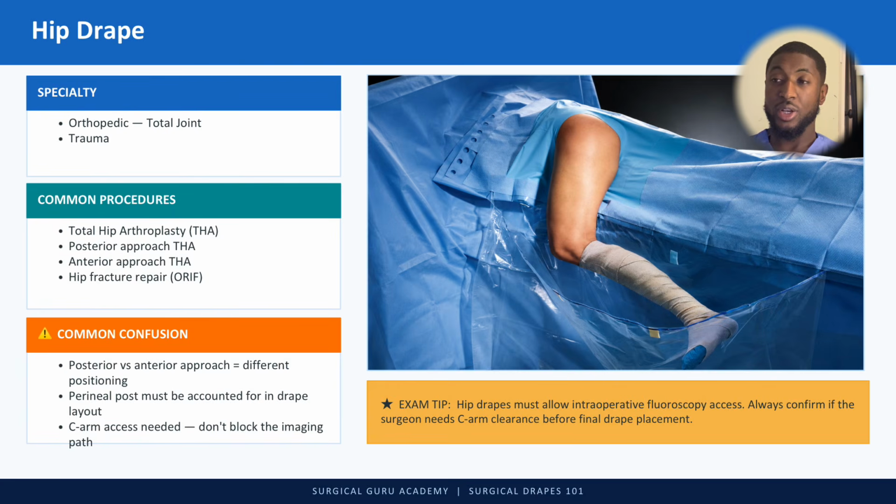So with the shower curtain, the last time that I did it, the doctor actually let it lay down on the patient on the other side, and I needed to drape the C-arm as well. I've been places where they put the post up on the fracture table so high that the shower curtain actually goes over the post, and the C-arm can come in without contaminating the field because it stays on the other side of the curtain. So again, this always depends on the doctor's preferences and how they like to do things.